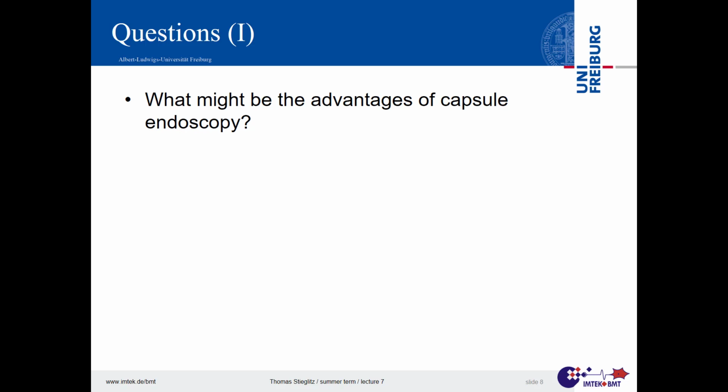And different things could be, for example, stopping, holding tight, taking samples of tissue. If you want to do biopsy, well, you could say, it would be much more of a dream to have a small genetic laboratory on board, where you could do PCR analysis on the spot or so. But I stopped with that. That would be probably too challenging there. But at least something like, can't we take biopsies there?